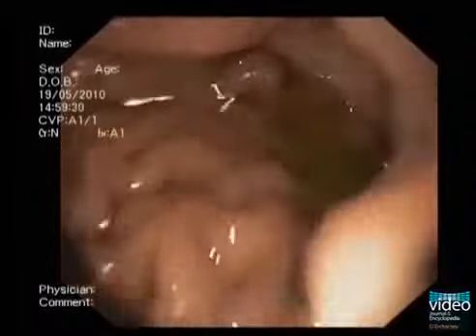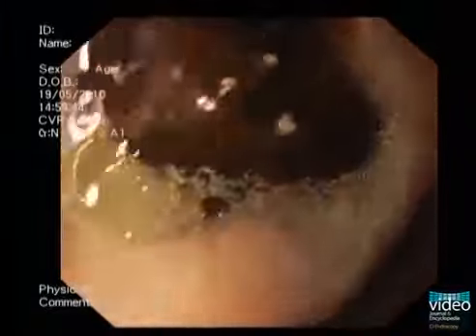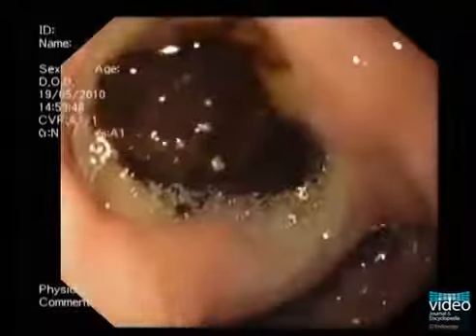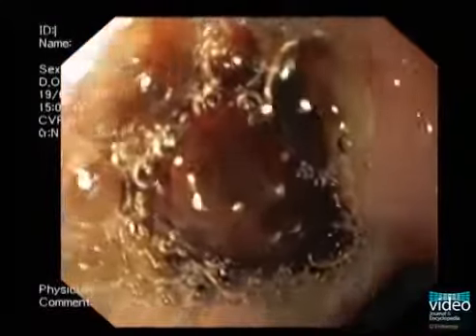Peptic ulcer bleeding is the most common source of non-variceal upper gastrointestinal bleeding. In this patient, an ulcer with an adherent clot was found in the duodenal bulb. An adherent clot is usually defined as a clot resistant to forceful irrigation or suction.